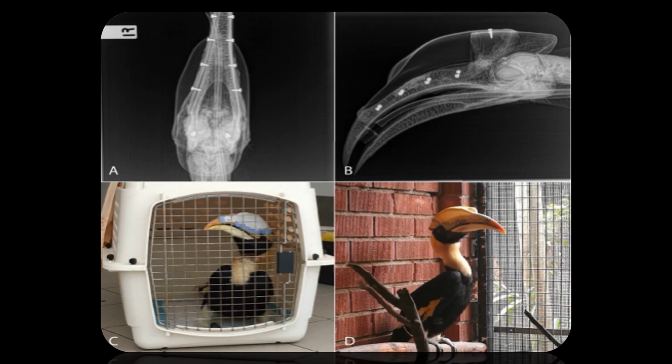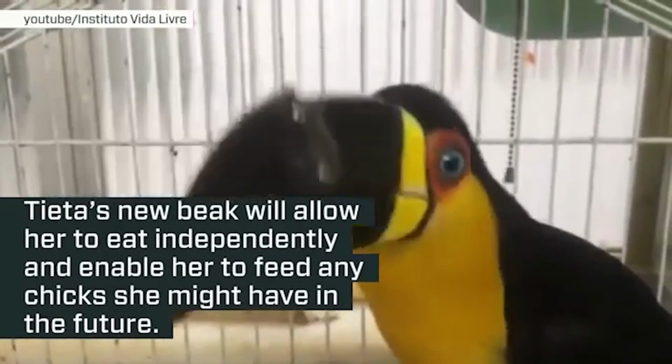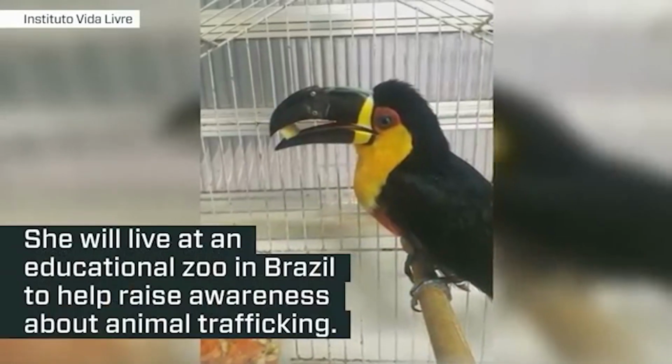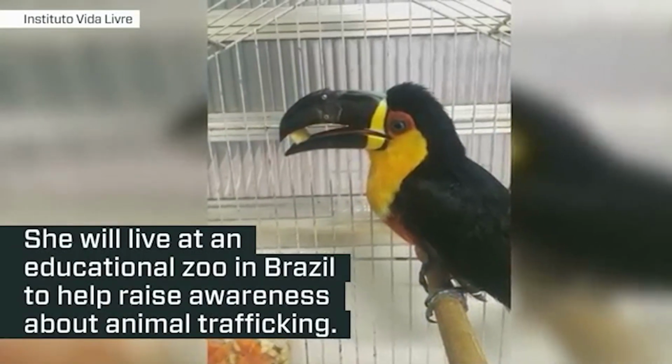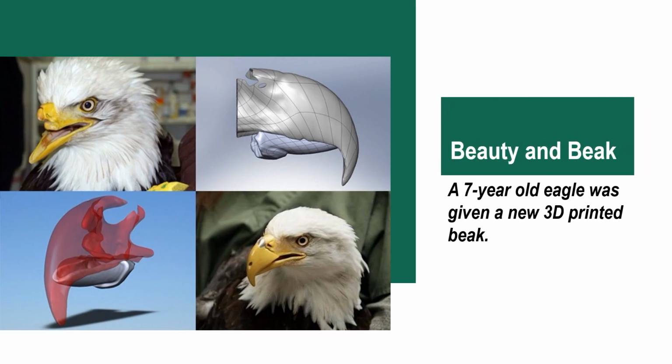And printing the part and doing the assembly. So you can see this is the 3D printed beak over here. Similarly, a number of cases have been reported throughout the world in which people have done the surgery using 3D printing. This is another case in which 3D printing for the eagle beak has been used.